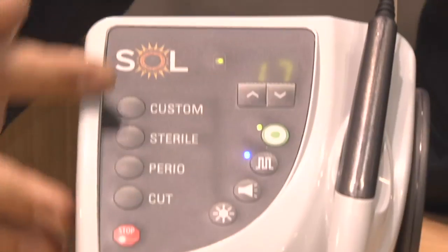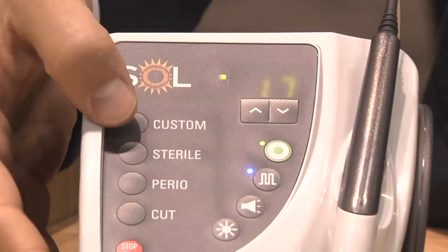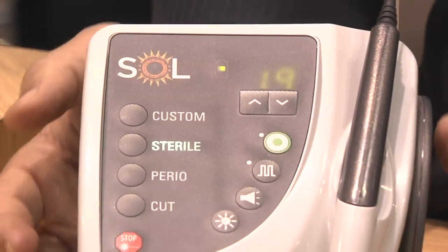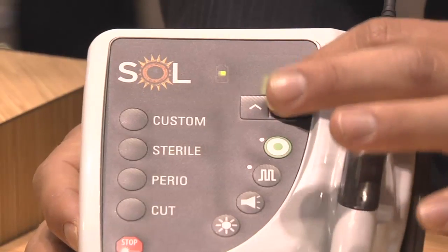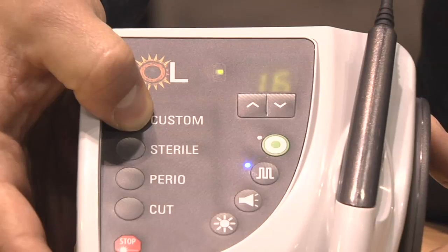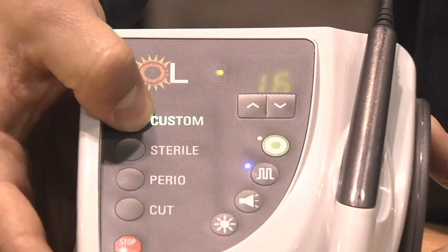Other features include preset procedures. There are four presets on the Sol, and each one can be customized similar to changing a car radio station. To change the station, you simply set the power you want, hold it down for three seconds, and it will change for you.